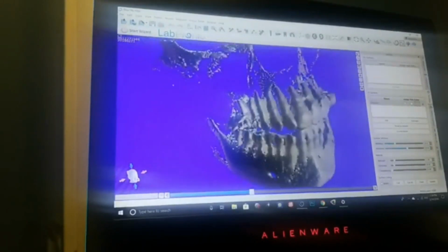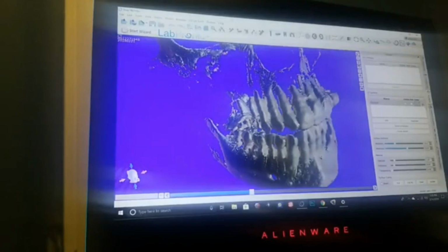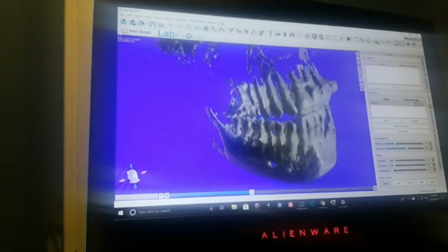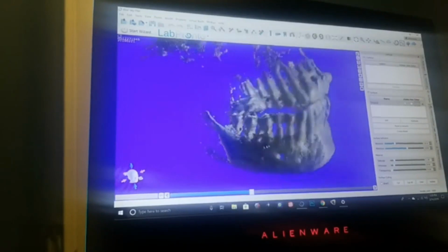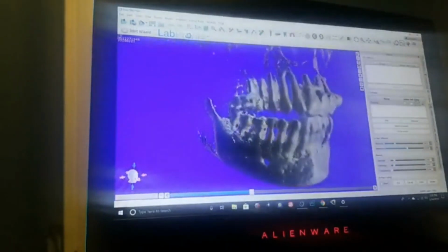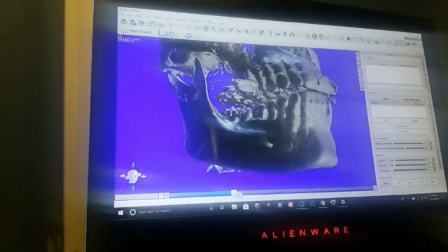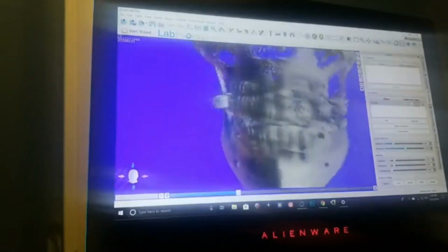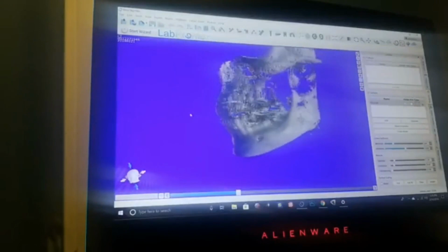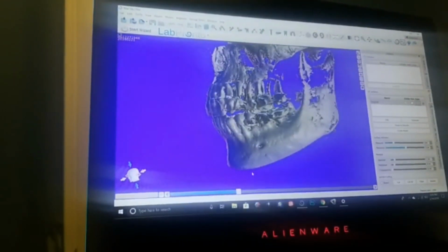That's why we drill on teeth with high speed and a lot of irrigation, versus drilling into the bone at a much slower speed. So you can understand that. Therefore you can change the density, and we're going to get there and talk about what it really means as far as density is concerned and how that's going to help us.